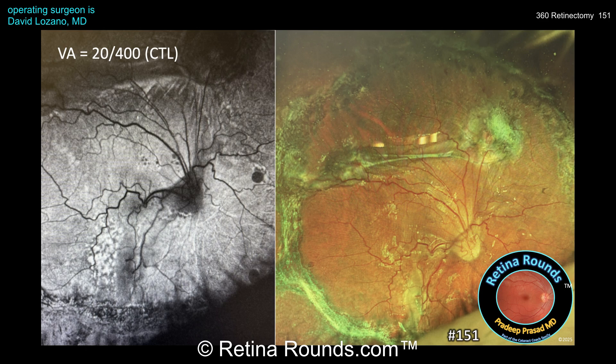Here are the patient's postoperative fundus and autofluorescence photos. You can see that the retina is reattached under silicone oil, although there appears to be some residual subretinal bands and rotational displacement of the retina. Without this surgery, this patient's eye likely would have become phthisical. And remarkably, he was able to achieve 20/400 vision with a contact lens.